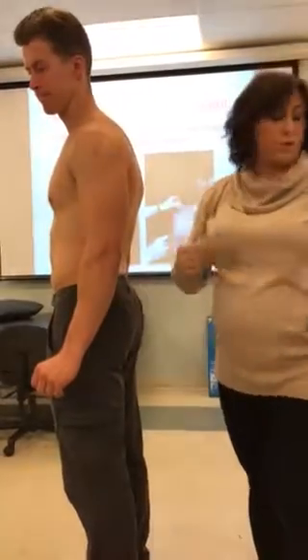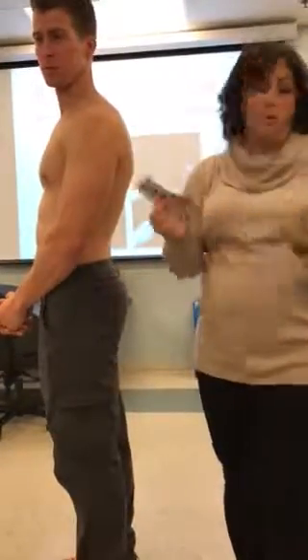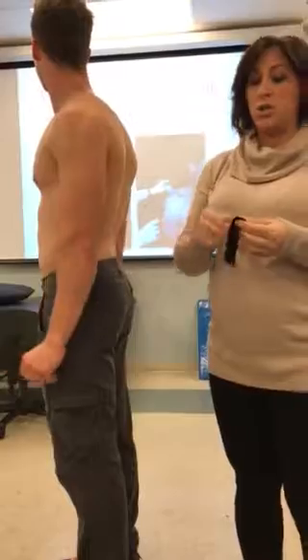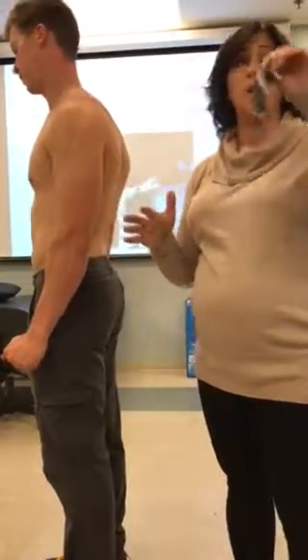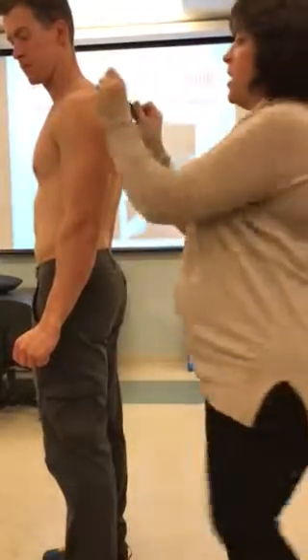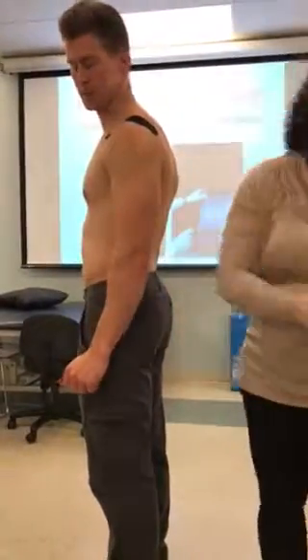So if it's a true overhead athlete, just like we did on the hip, we took 3 and/or 4 strips, and we're going to create an asterisk or a star symbol. You're going to do it with 75%, 50 to 70 to 100% tension out, because you've got to create the blocking technique. So you're going to hold it like this, stretch, and wherever that AC joint is creating the step up, you push it back down. Okay, and then you take your pieces off.